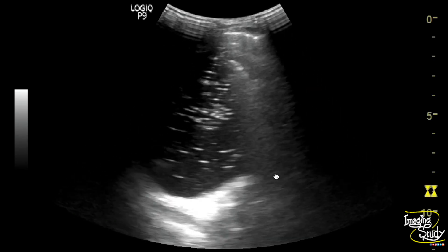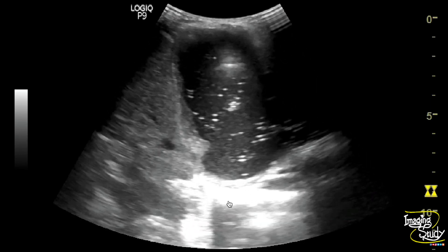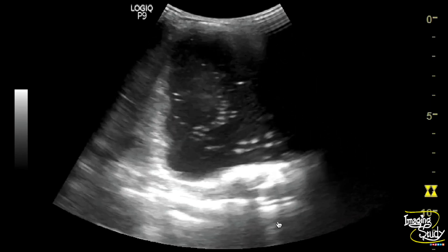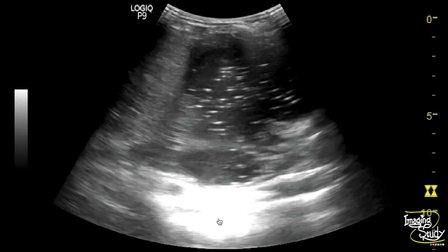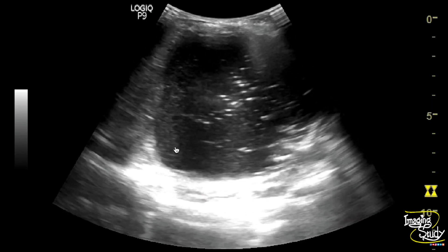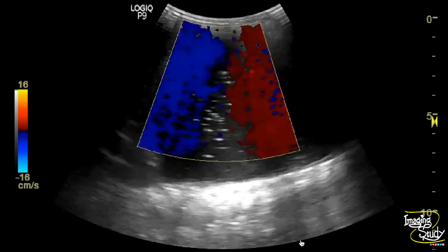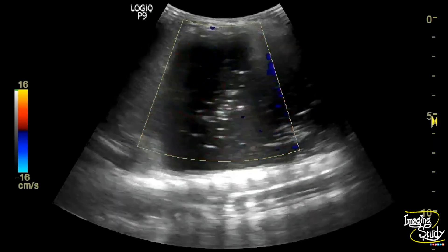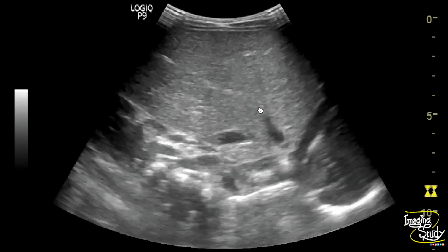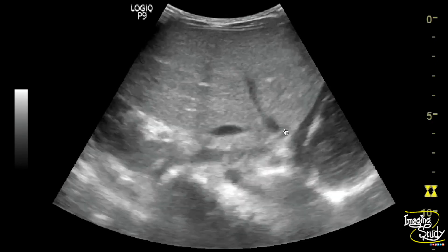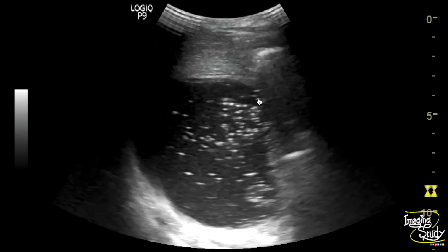This hypoechoic content is the thick debris, so this content is the pus. We have aspirated the fluid for confirmation and it shows thick pus. So this is the case of pleural empyema. This is the pleural margin and it appears thickened.